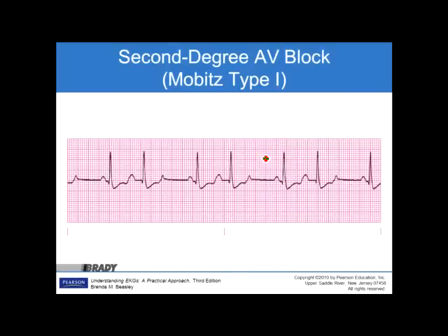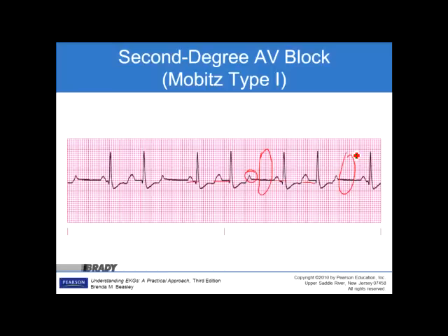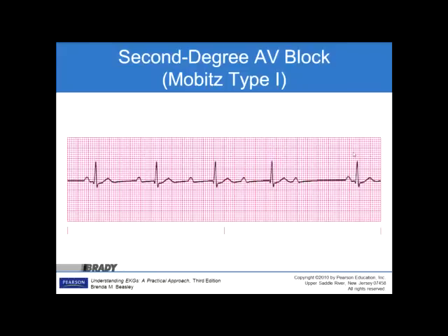Again, a second degree Mobitz type 1 — P waves firing, P waves firing, then where is the QRS? Dropped. The PR interval slowly progresses until we drop a beat. In this elongated example: the PR interval is wider, wider still, way wide — then a dropped beat. Slowly progressive PR interval increase until we drop a beat.